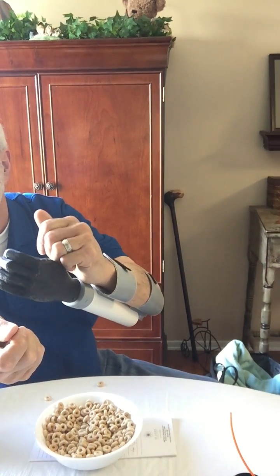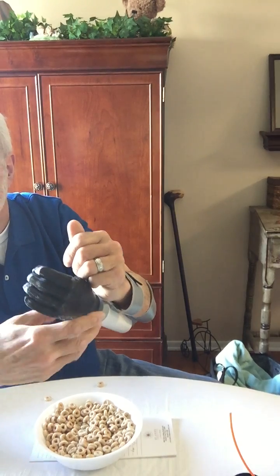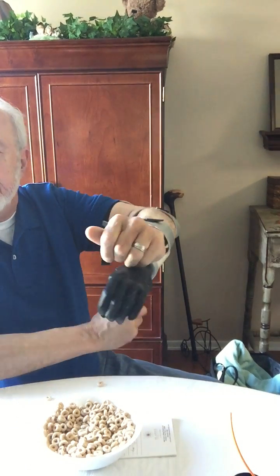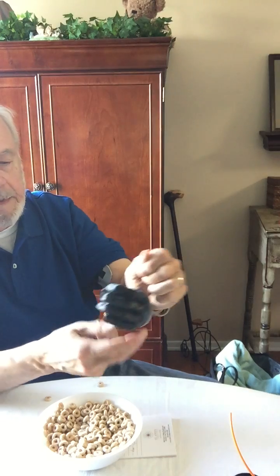So the clinician can use this as a demonstrator. The designer can use it to work the bugs out of the design and discover things like, is the orientation going to be where it needs to be to do the job that you want it to do for whatever the task is.